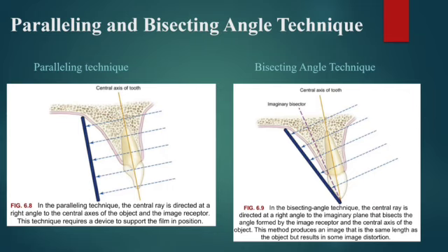To achieve this parallel orientation, the practitioner often must position the image receptor toward the middle of the oral cavity, away from the teeth. Although this allows the teeth and image receptor to be parallel, it increases the object to receptor distance and results in some image magnification and geometric unsharpness.